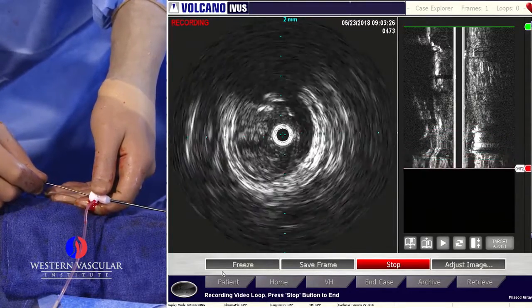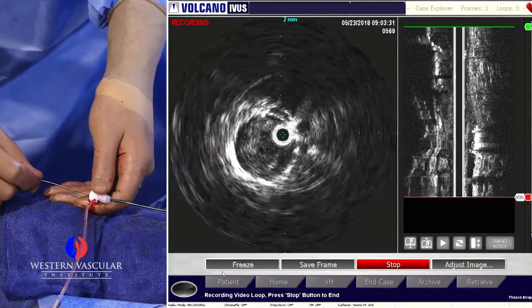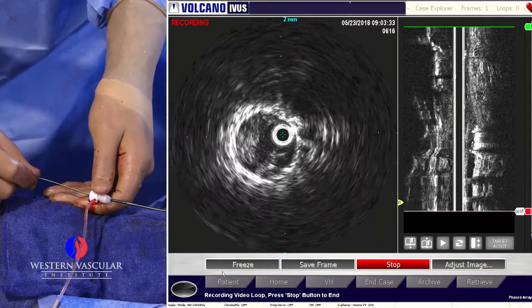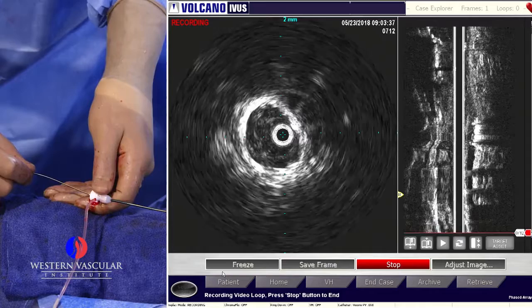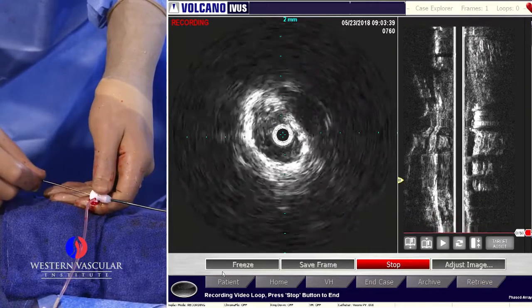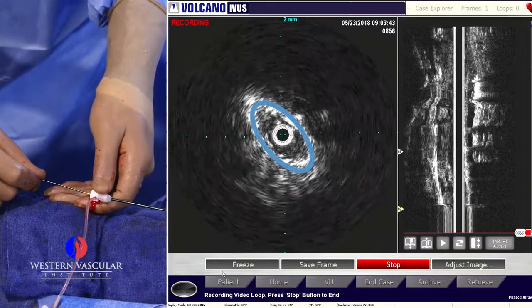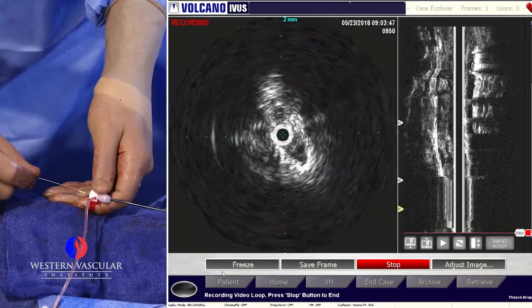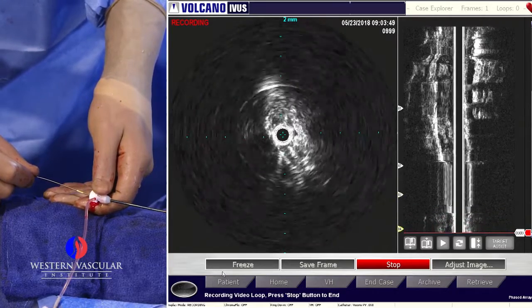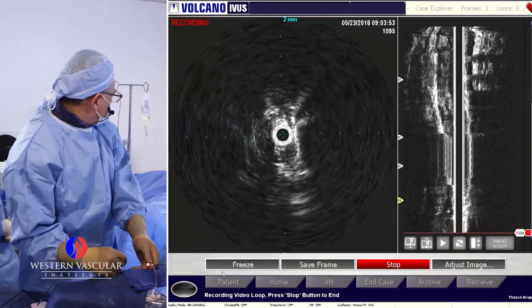Pretty soon we're going to approach the stent, and you will see the very bright marks of a stent right there. Sometimes it looks like a sunburst coming off every time that we pass a cell. So we are in good location. Look at the stent here. It's completely collapsed. It's almost like an X shape right there. Very tight right here in this area. No wonder the vessel got occluded.